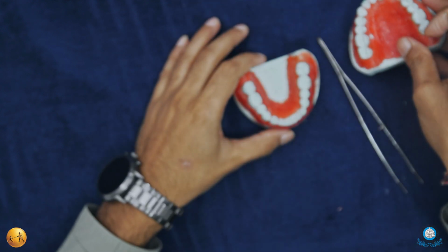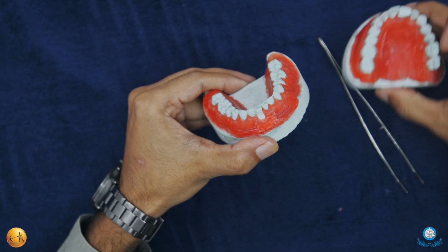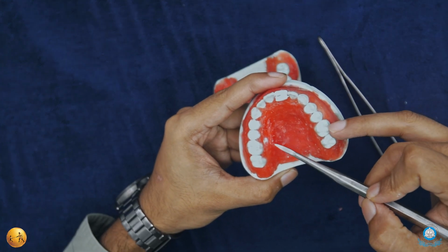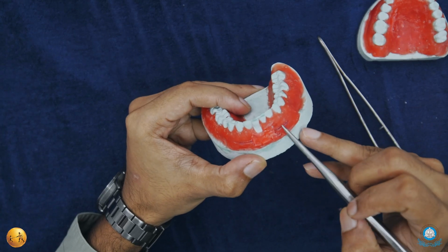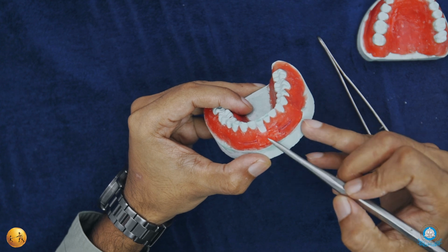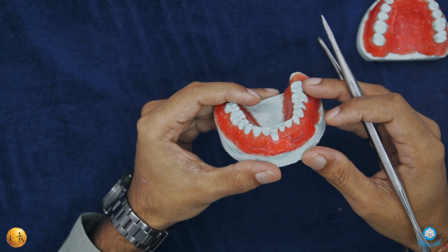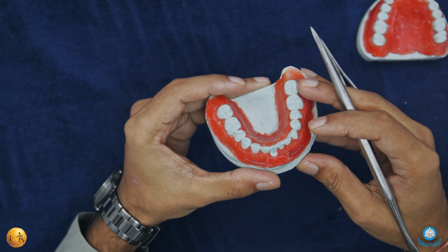Okay, so step 1 is preparing the recipient site. Step 2 is harvesting the graft from the palate. Step 3 is stabilizing the graft, and step 4 would be suturing and maintenance of the donor site. Now this graft will be covered by a periodontal pack or dressing which will be removed after 1 week. Suturing would be removed after 2 weeks. So that's how free gingival graft can be used to increase the width of attached gingiva around class 2 gingival recessions.